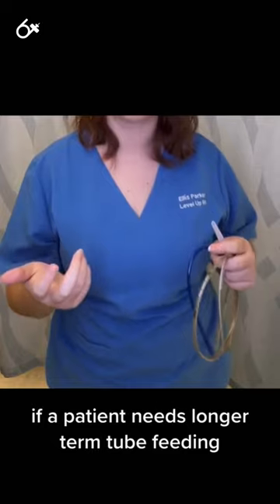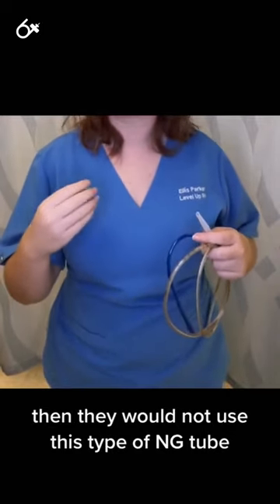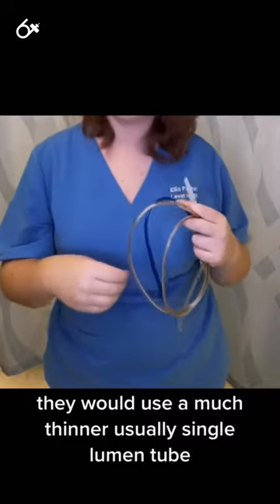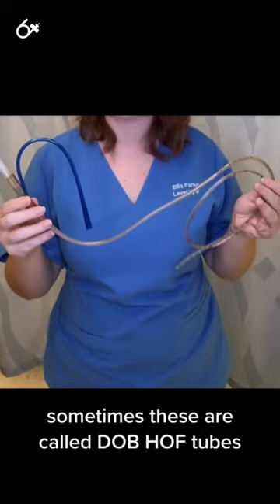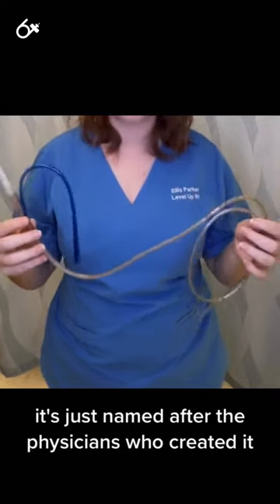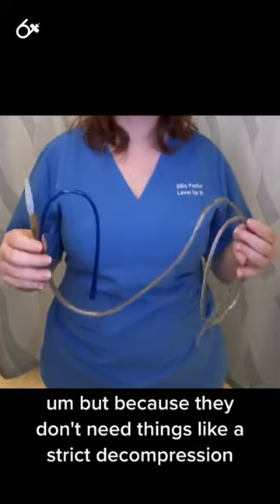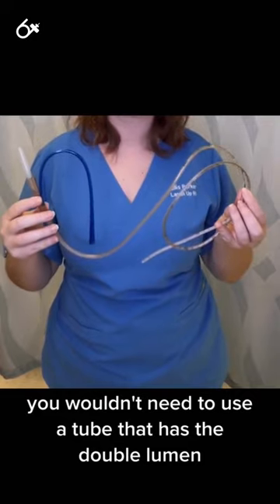If a patient needs longer-term tube feeding, they would not use this type of NG tube. They would use a much thinner, usually single-lumen tube. Sometimes these are called Dobhof tubes, named after the physicians who created them. Because they don't need things like gastric decompression, you wouldn't need to use a tube that has the double lumen.